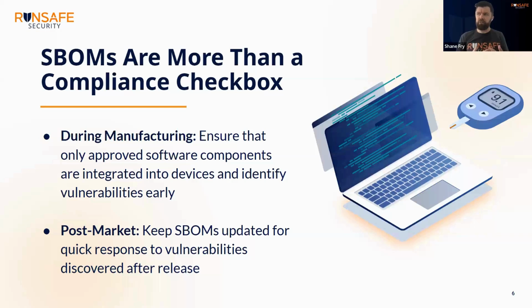We like to talk to people in the latter camp there and say, hey, you need to put pressure on your vendors to give you SBOMs, to give you secure software. And a lot of them go, well, we don't have an SBOM. It's like, well, that's step one. You've got to ask for it.